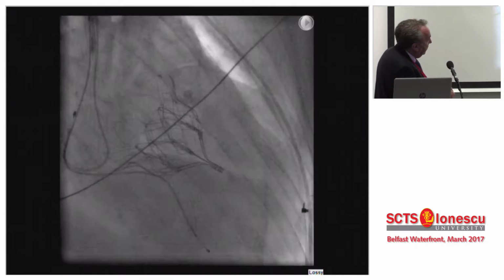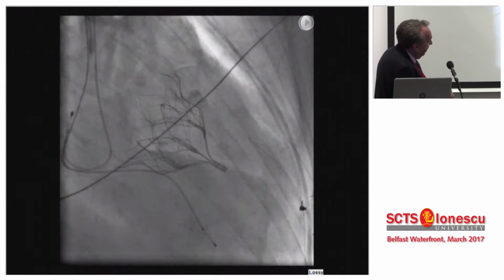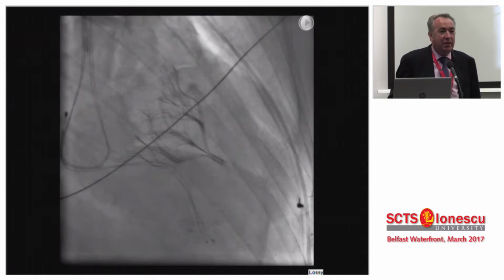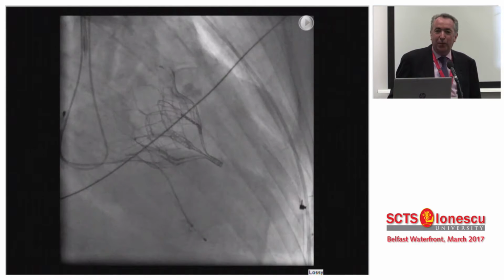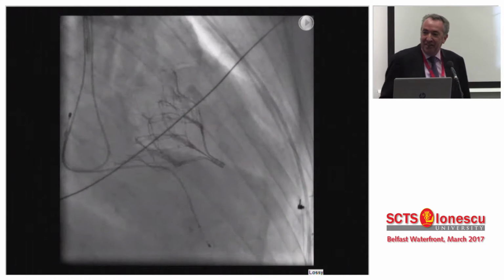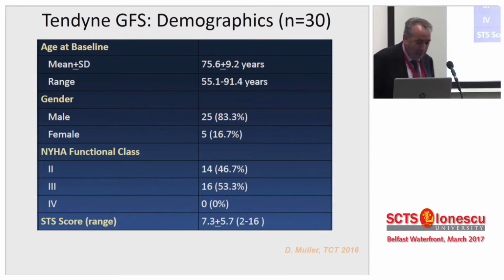titanium pin that pins through the tether and through the apical pad. And one of the nice things when we started doing this was the apical pad was a very effective apical closure device, and really you almost didn't need to tie down your purse string sutures at the end once you'd put the pad in place.